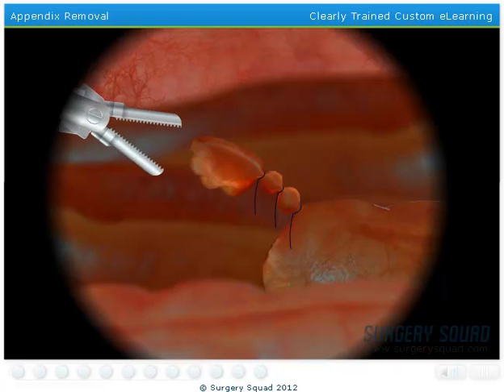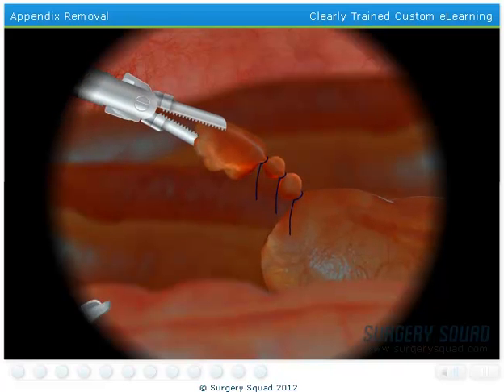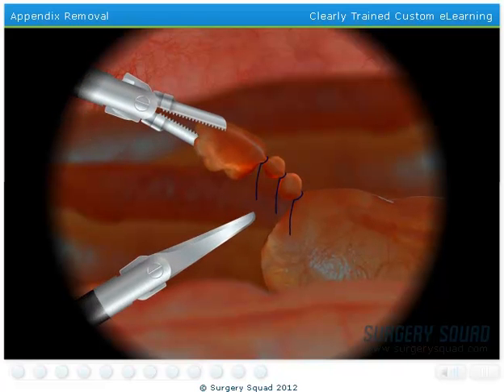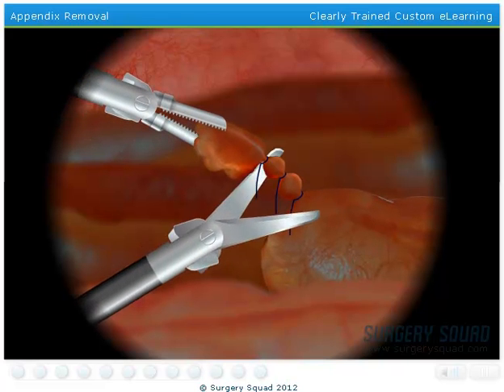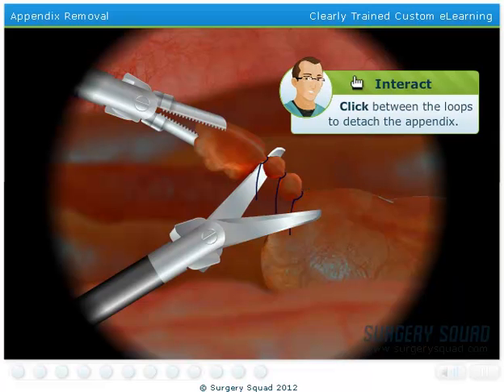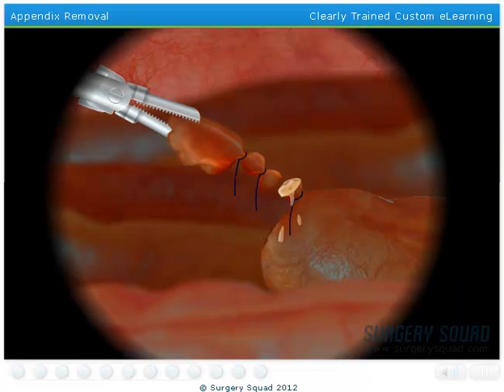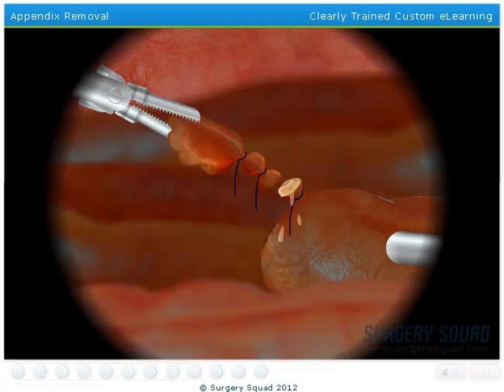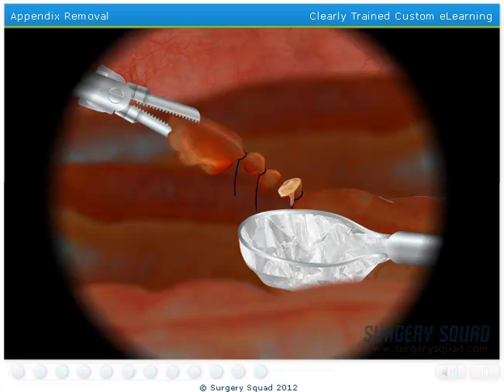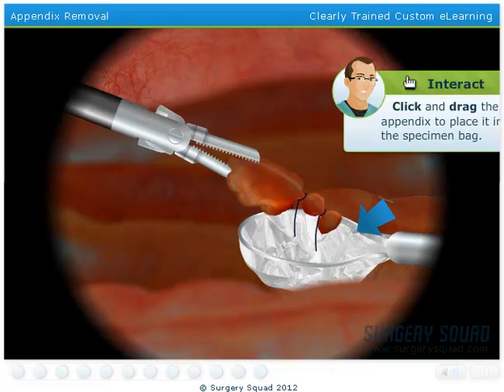Now we need to remove the appendix. Use the scissors to snip between the loops. Notice that when you snip, a little pus comes out, indicating that the appendix is infected. Don't worry about it though, we'll clean up everything. To remove the appendix from the abdomen, place it into the specimen bag and pull it out through the trocar.